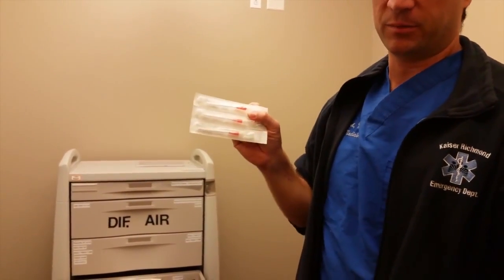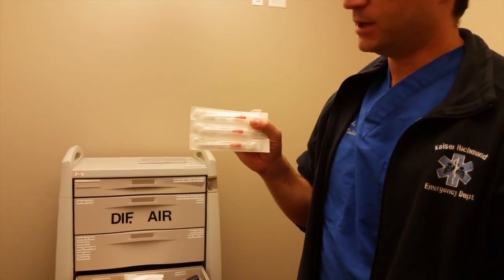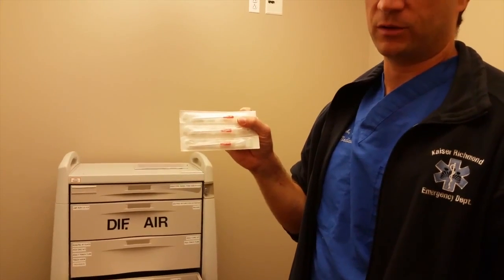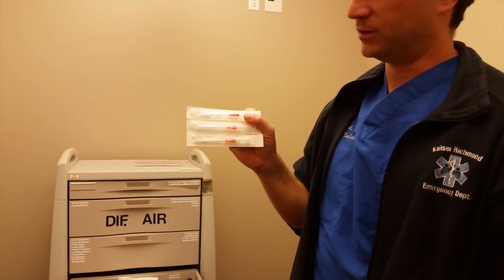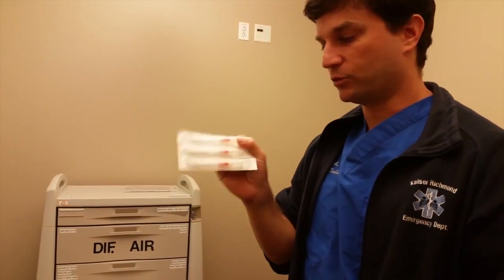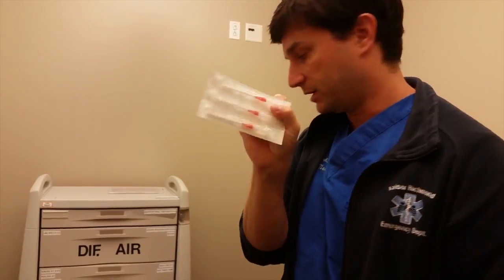Really, this comes up in the pediatric population that's more or less under 10 to 12, where the traditional teaching is that cricothyrotomy is not indicated, but really the problem is that they are too small for the tubes that we have available. So a good option in a surgical airway scenario there is to use a smaller tube, i.e. a 14 gauge catheter.